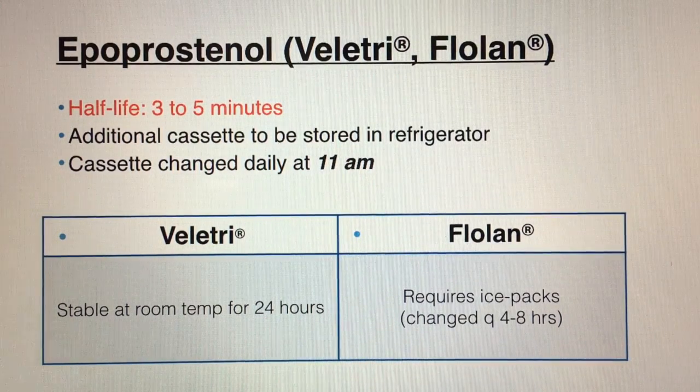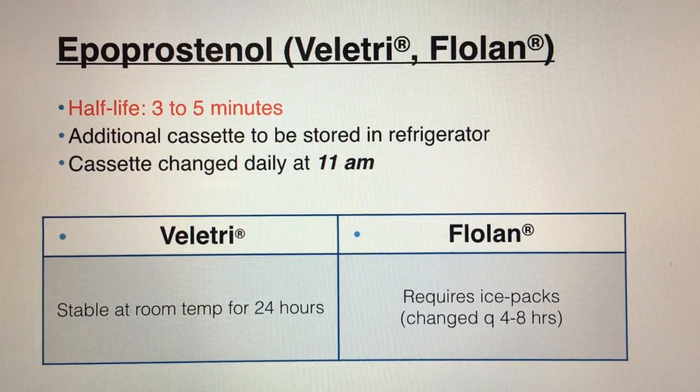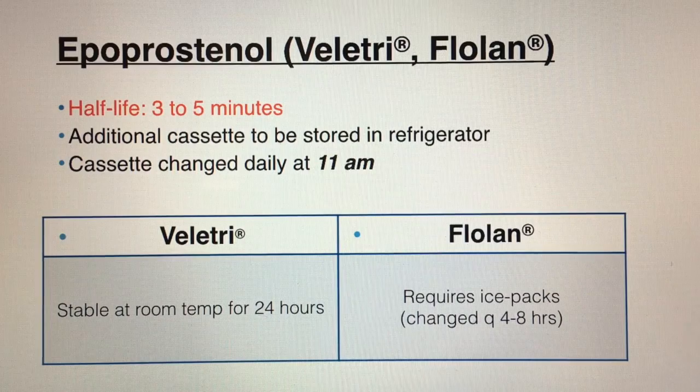The main difference is Flolan requires ice packs. The ice packs are scheduled in the MAR like any other medication. They are sent from pharmacy and they are scanned as any other medication would be.